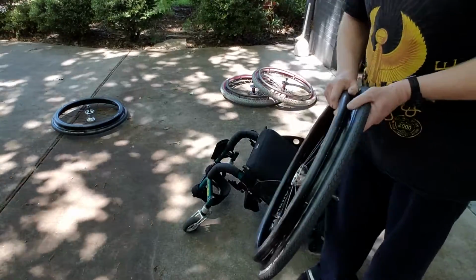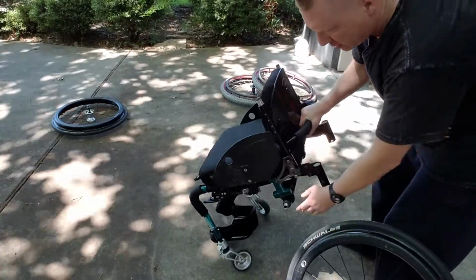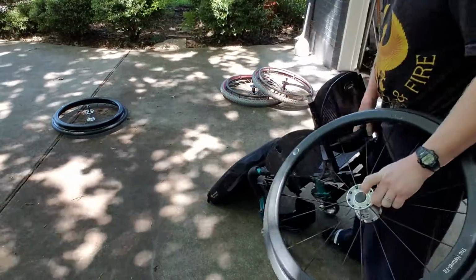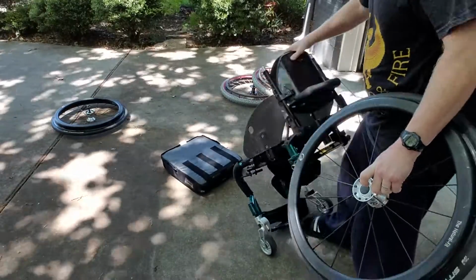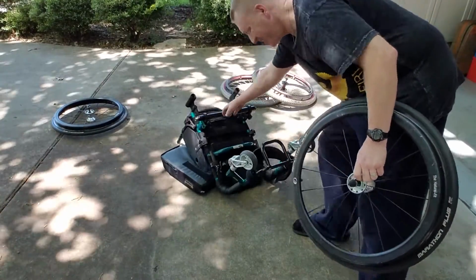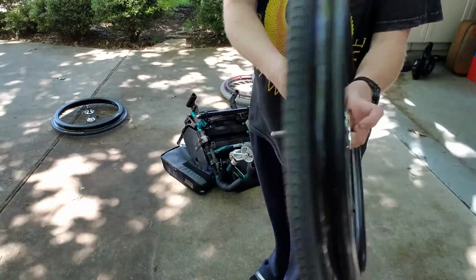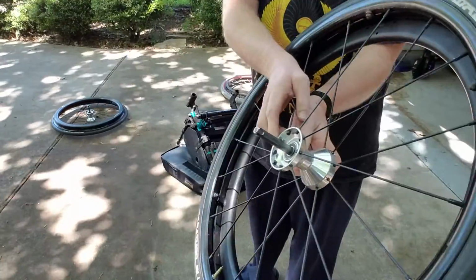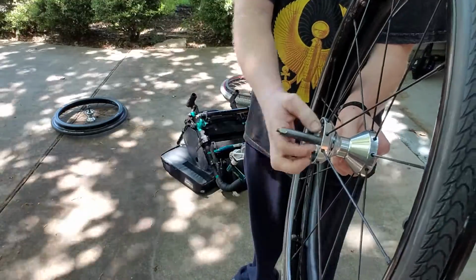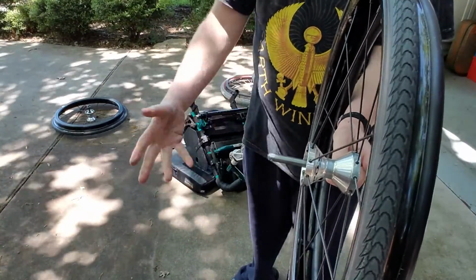When you're attaching the wheels, they slide into these little spaces right here, and I have some challenges, as you can see. When you're sliding it in, in order for it to release, when you press this button right here, it pushes this out and it enables it so that this piece can slide into the hole. Then when you release it, this is what keeps it from sliding back out.